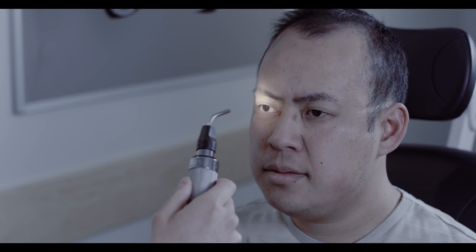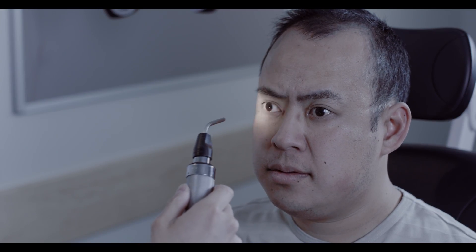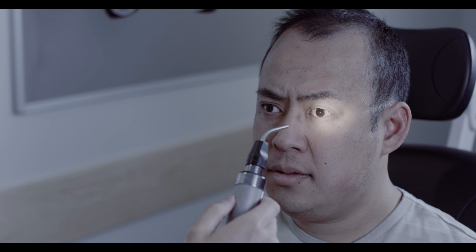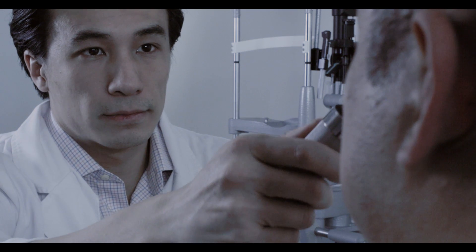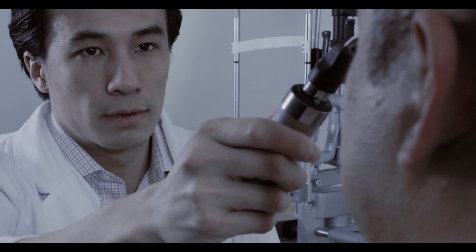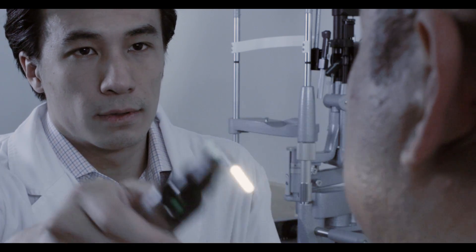When testing pupillary light reflex, the patient should fixate on a distant object. This prevents normal eye convergence, accommodation, and associated pupil constriction.